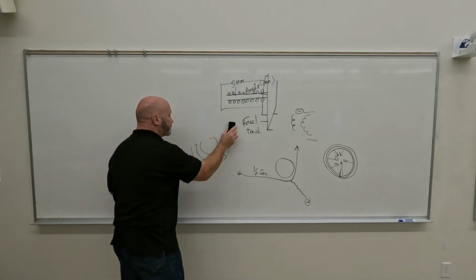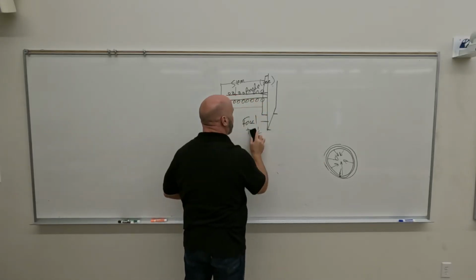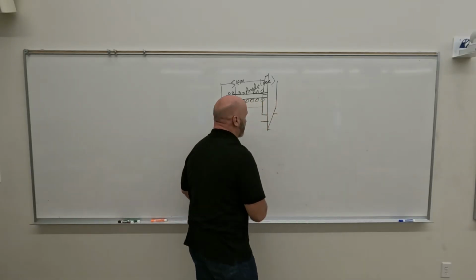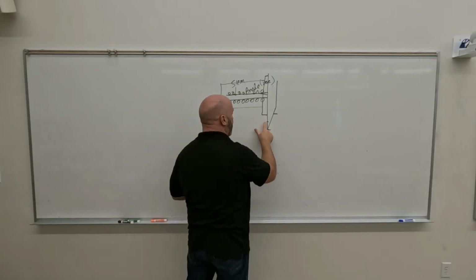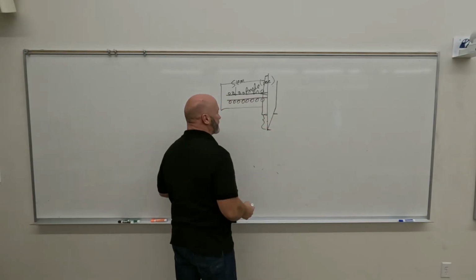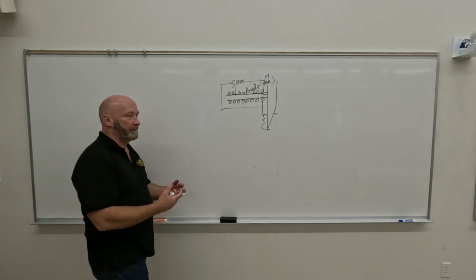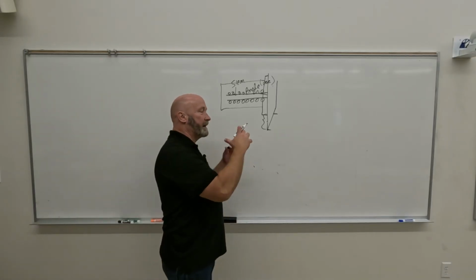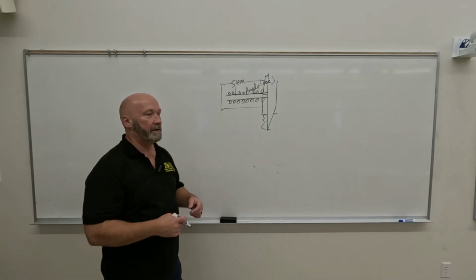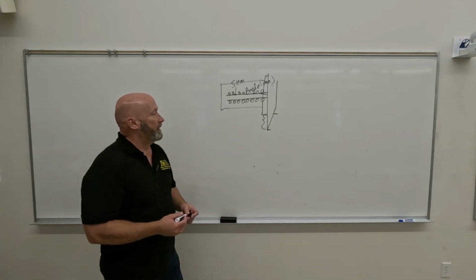All right, so let's get a little bit more specific in the focal track itself. Okay. So the focal track is the actual area of bombardment on the disc. Okay. So again, the entire disc is not the target. The target is actually your focal track. It's where you're aiming your electrons. It's where you want your bombardment to take place. Much smaller than what I've drawn here.